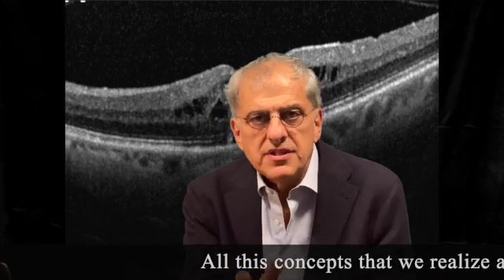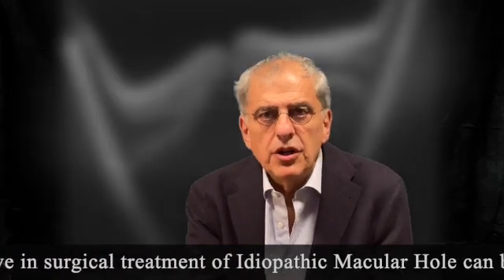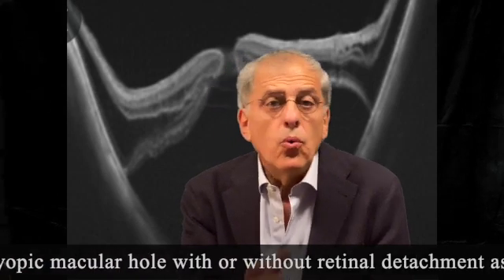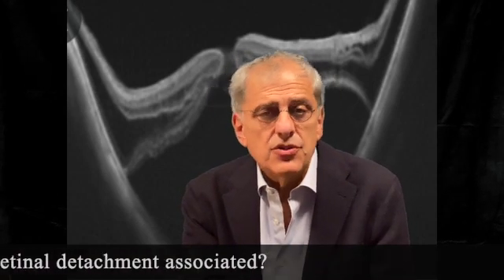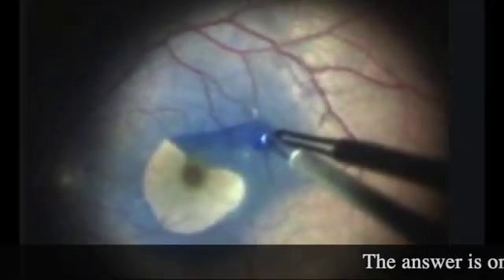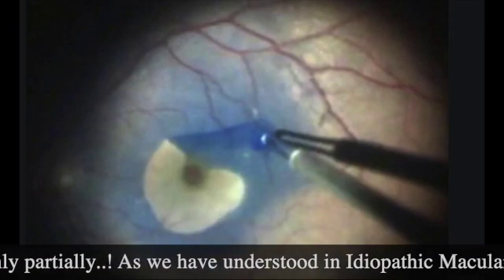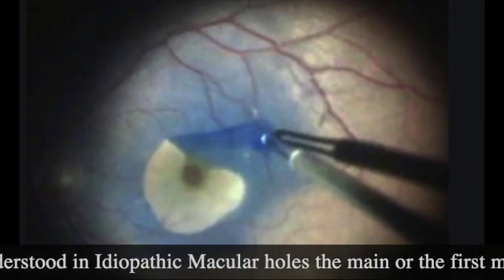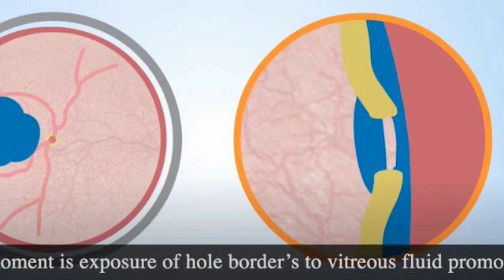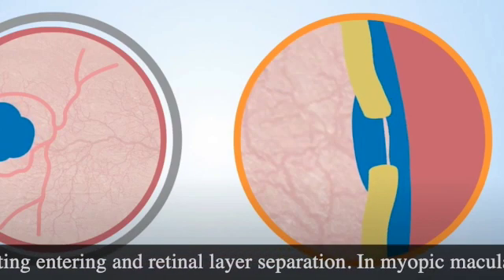All these concepts that we realize are quite effective in surgical treatment of idiopathic macular hole, can they be applied to myopic macular hole with or without retinal detachment associated? The answer is only partially. As we have understood in idiopathic macular holes, the main or the first moment is exposure of hole borders to vitreous fluid, promoting entering and retinal layer separation.